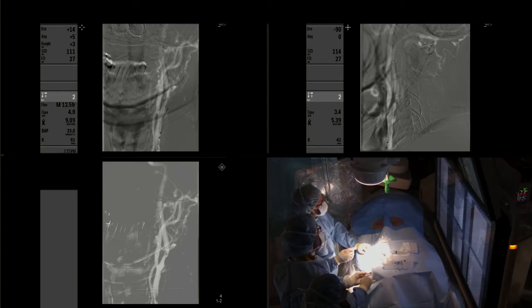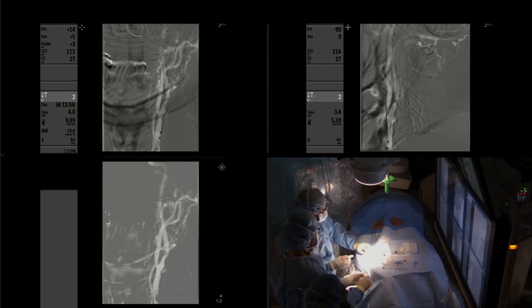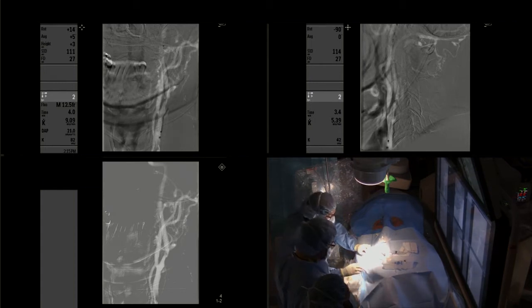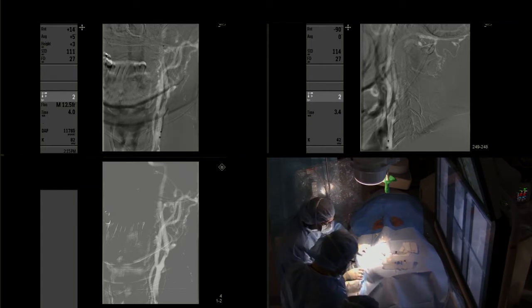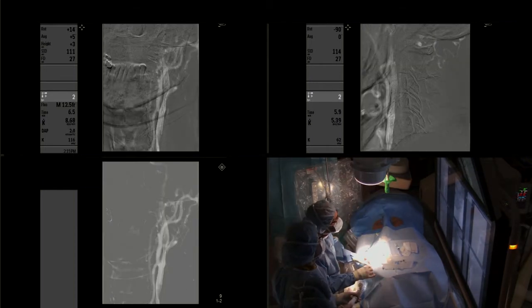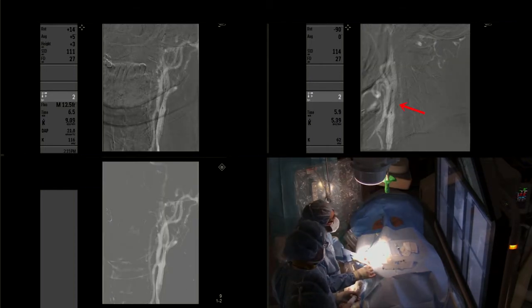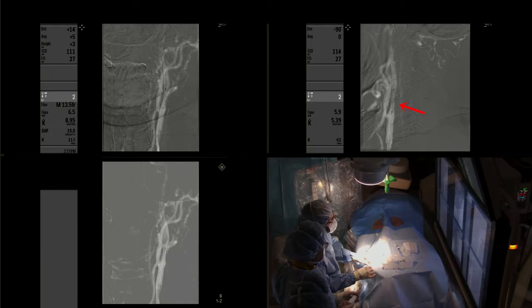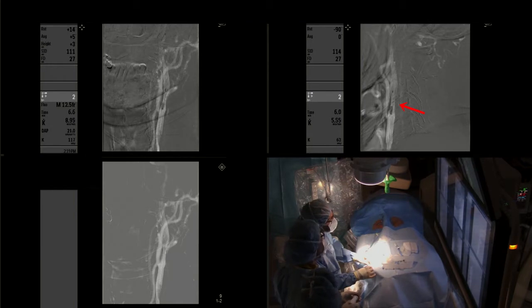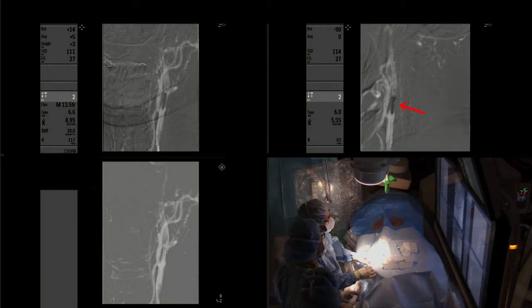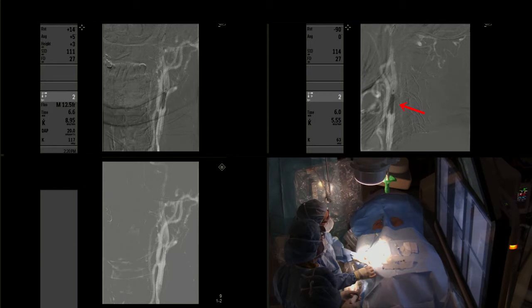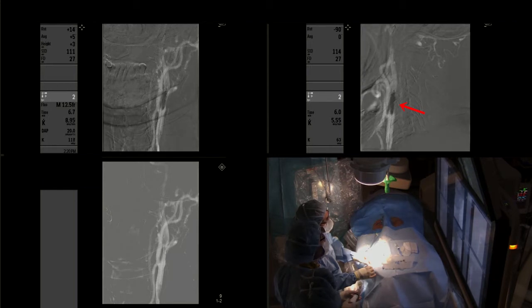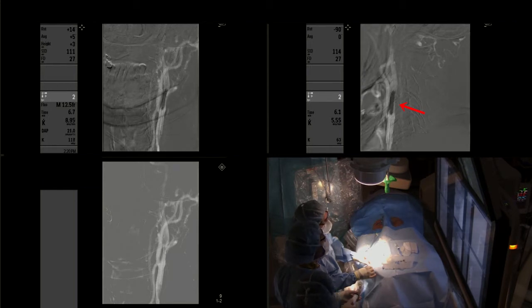You are seeing a good expansion of the stent. It is a self-expanding stent and still has a little waist in the middle, and that is why we are performing balloon angioplasty using a Sterling 4 mm by 20 mm balloon micro catheter.